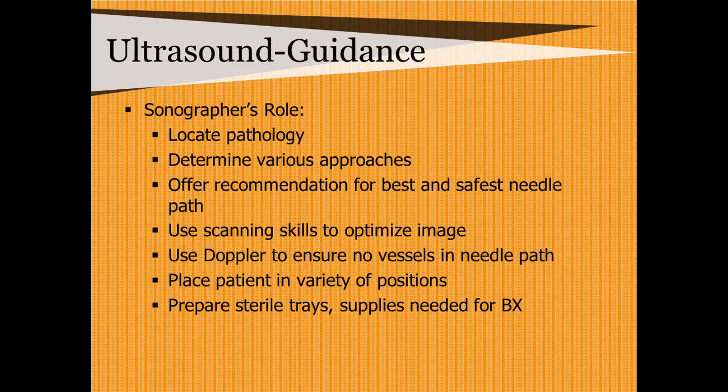So your role as a sonographer is to locate pathology, determine various approaches. The radiologist does this as well, but you're oftentimes a team working on this. You can offer recommendations for best and safest needle path. You can use your scanning skills to optimize the image for them. They're all gloved up. You're going to adjust things on the machine while they're gloved.